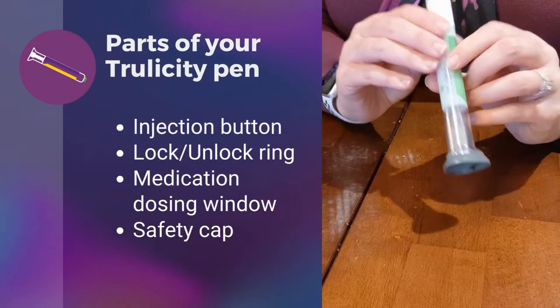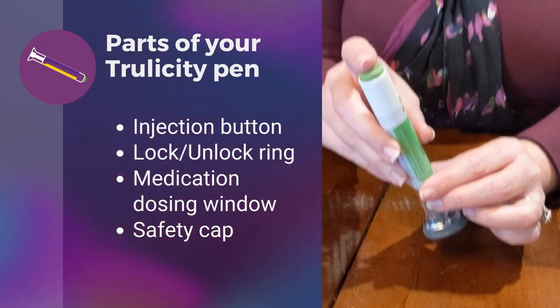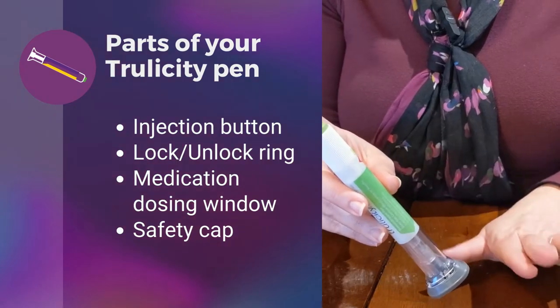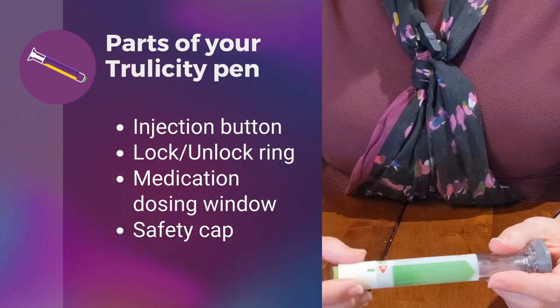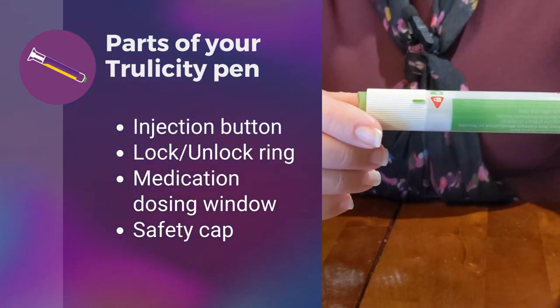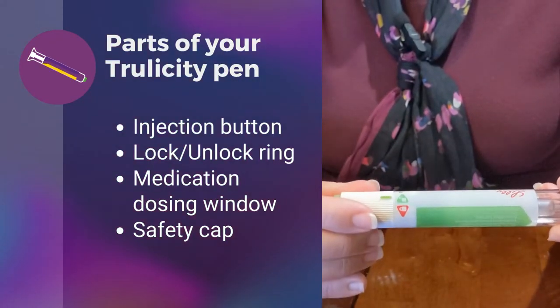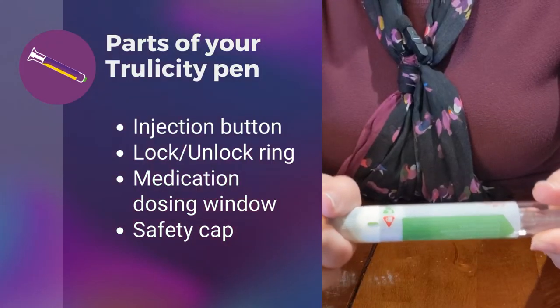Now I'd like to briefly go over this pen. This green button here is what you will press when you are ready to give your injection. This white portion is what you will twist to either lock — and currently it's in the locked position — or you're going to twist it to unlock it just before you're ready to give your injection. But we're not going to do that yet, so I'm going to put it back to lock.